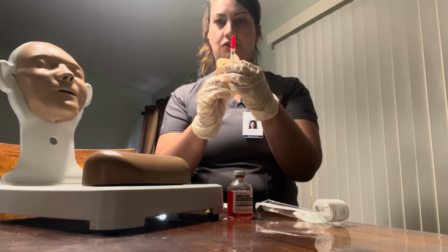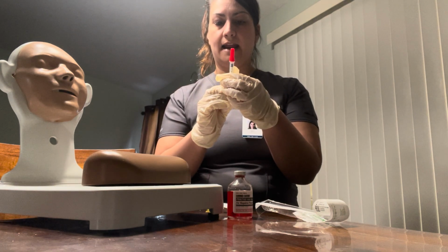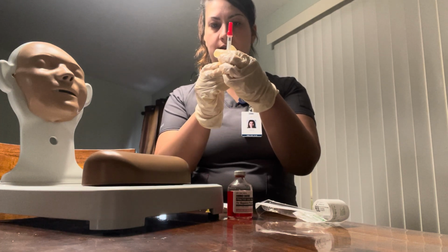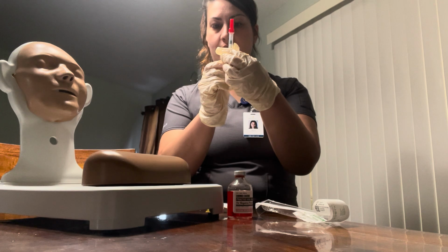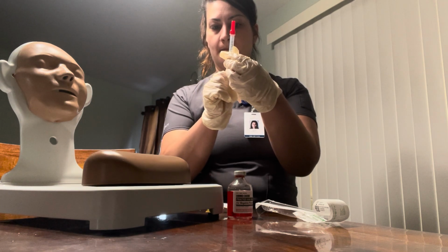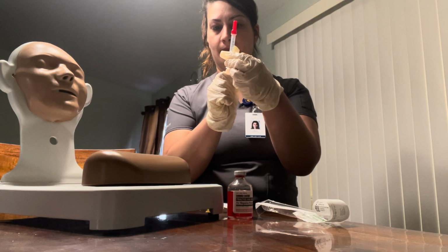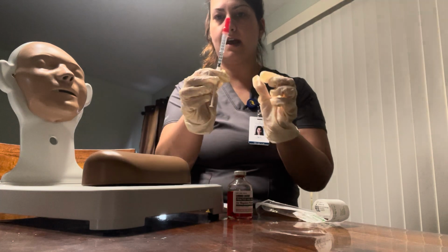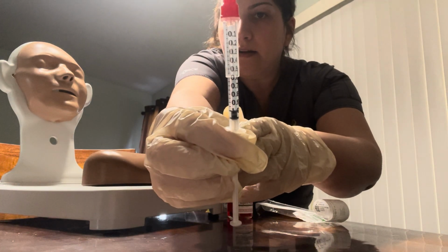And we will draw in air equal to 1 milliliter for the patient. So I'm gonna draw in 1 milliliter of air. Okay, and I will show you guys 1 milliliter of air.